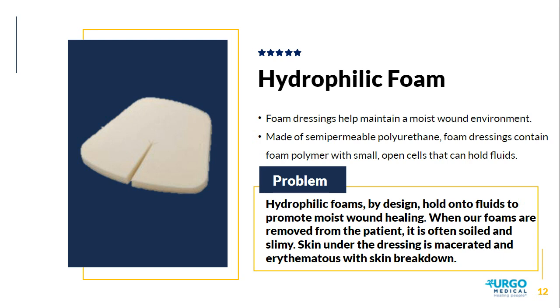However, in this particular case, when we're placing it around a tracheostomy, it does exactly that. It absorbs the fluid and holds it there, and it maintains that moist wound environment. And that truly is not the optimal place or environment for pressure injury prevention. In fact, it provides the best environment for pressure injury development. And as well, it also contributes to the perfect environment for infection.